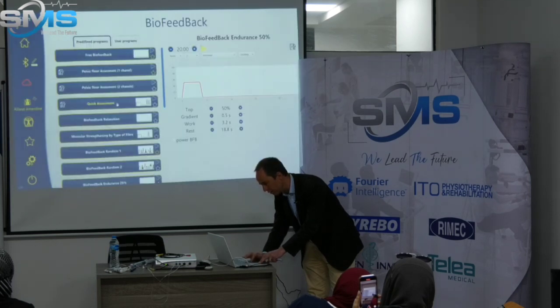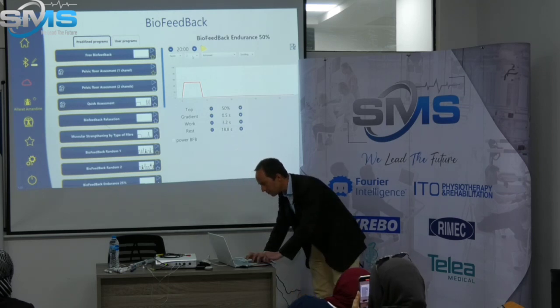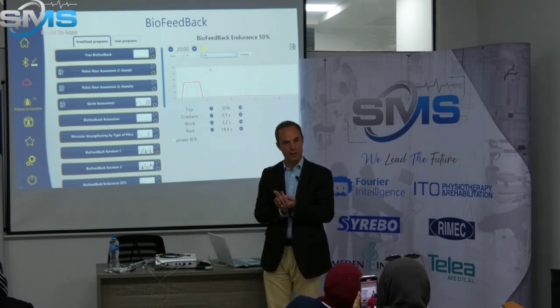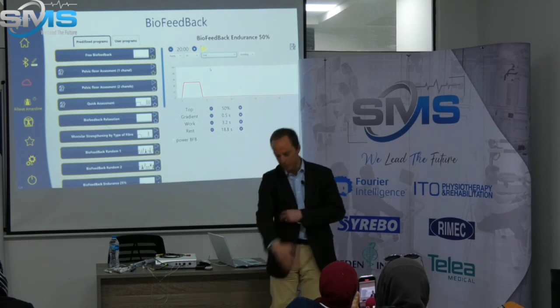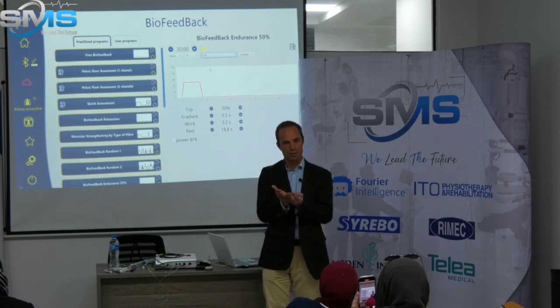Once you're doing this, there is also another important point, but I won't be able to show it easily. Now the other very important point is that sometimes when you ask your patient to contract, she contracts her pelvic floor, no problem, but she also contracts abdominals, she contracts glutes, she contracts legs, she contracts whatever is in this region. And you only need to contract the pelvic floor.